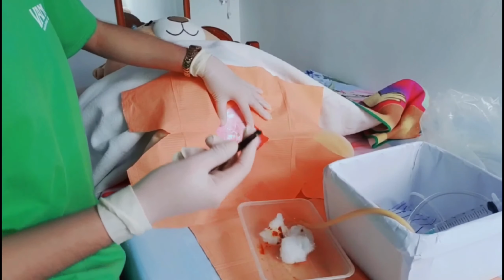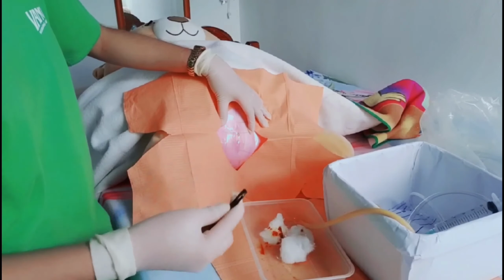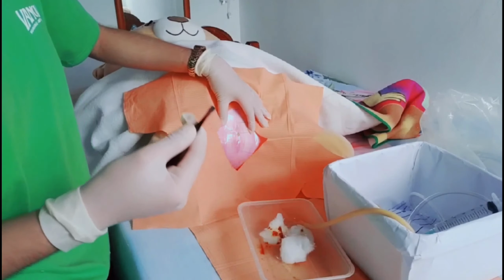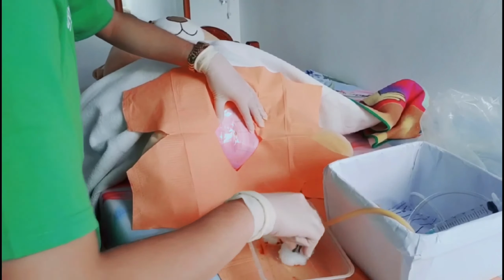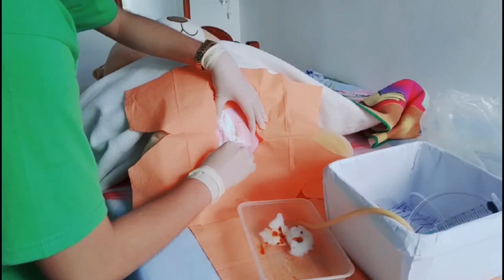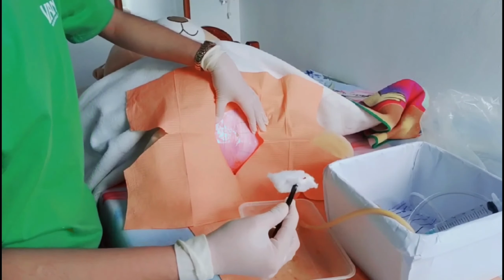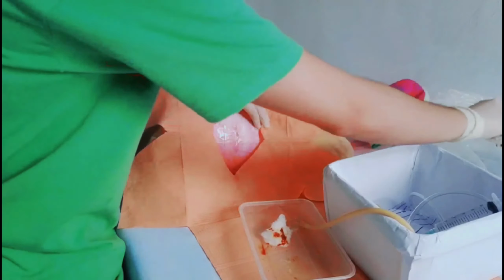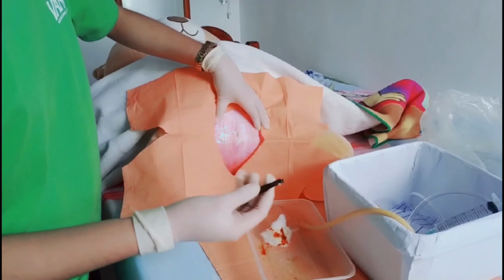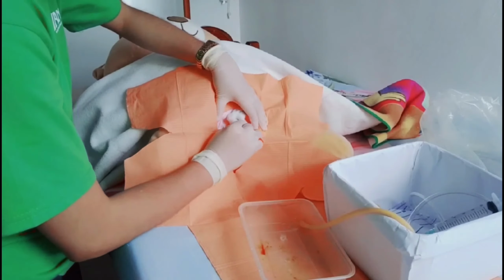Using cotton balls held with forceps, move the cotton ball from above the meatus down toward the rectum, because moving from an area where there is likely to be less contamination to an area where there is more contamination helps prevent the spread of microorganisms. Stroke and then discard. We're going to clean both labial folds and then directly over the meatus, because cleaning the meatus last helps reduce the possibility of introducing microorganisms into the bladder.